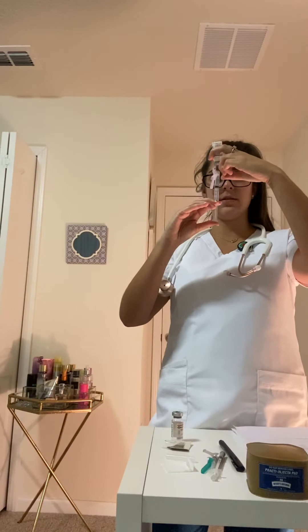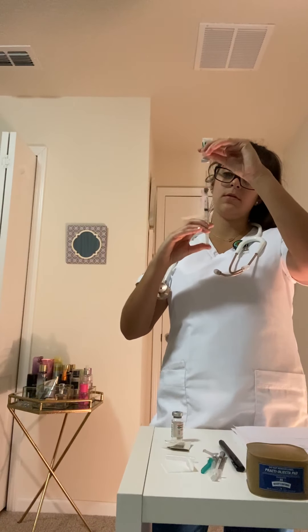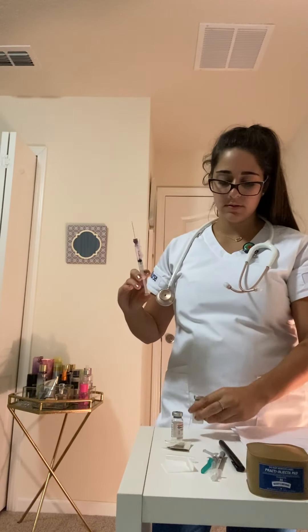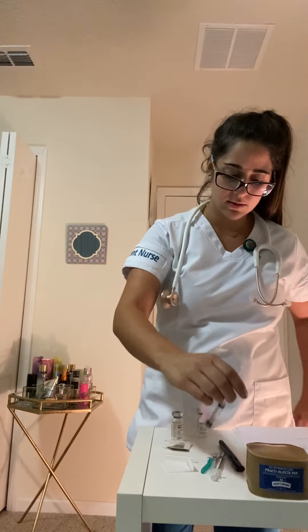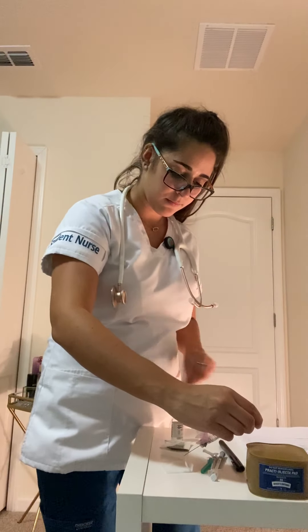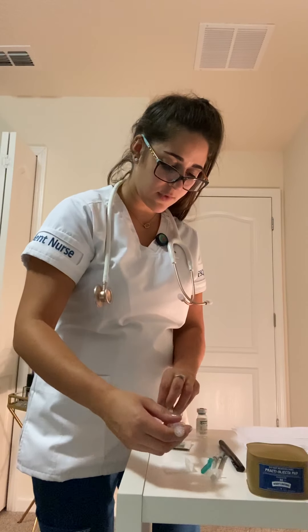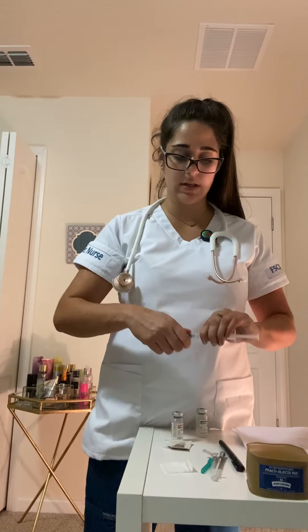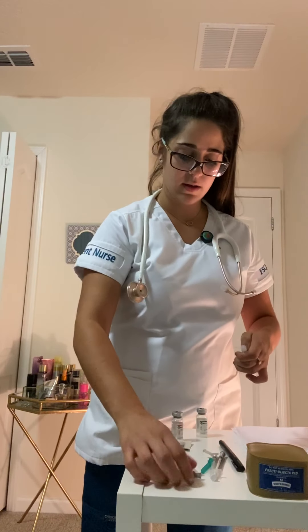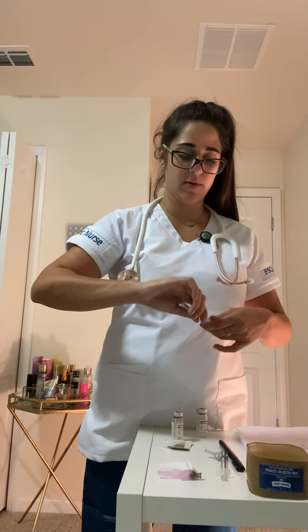I just like to double check for any air bubbles. It looks good to go. Going to cap that. And then for the intramuscular, you want to get a fresh needle tip — not the same one that you used to draw up the medication.